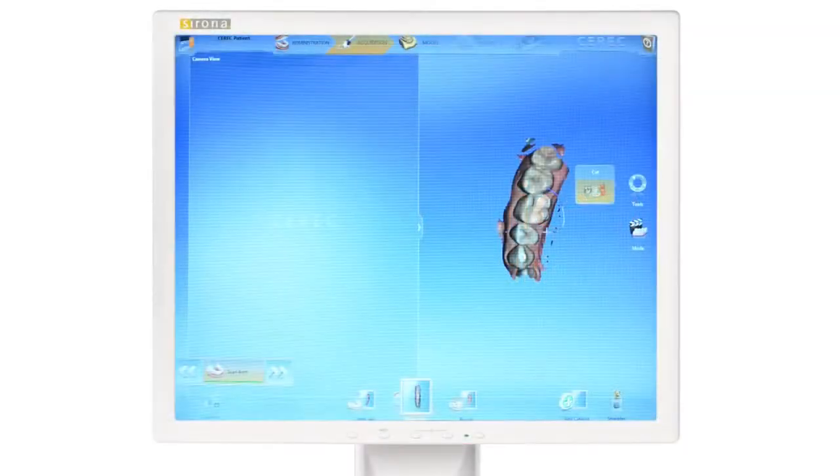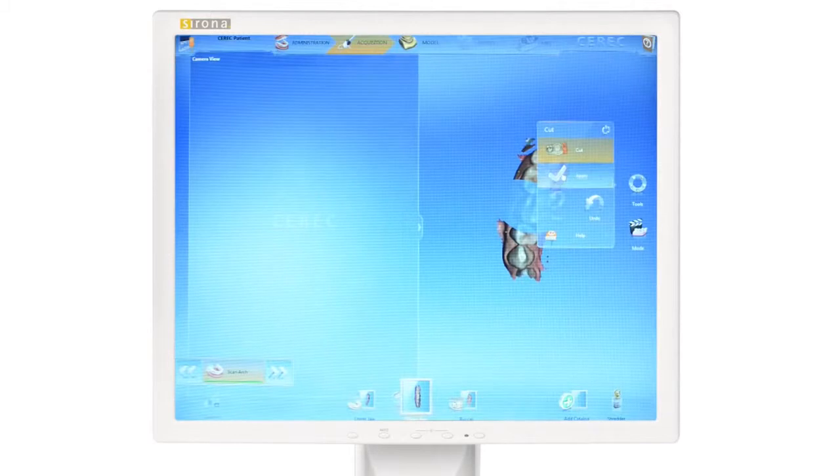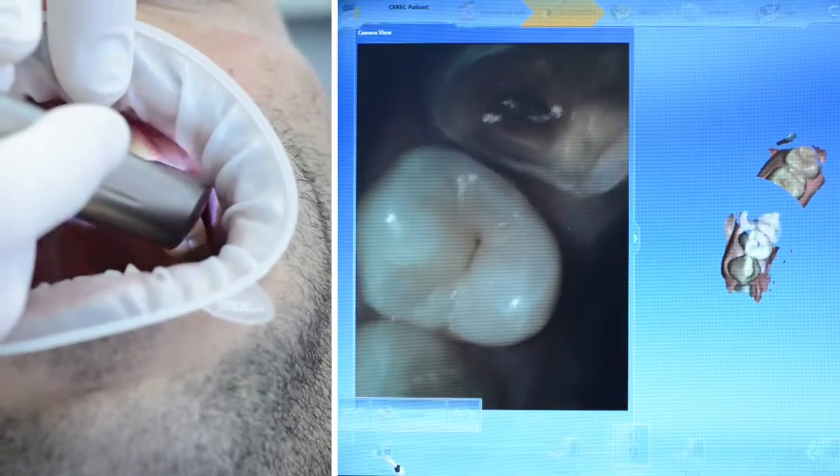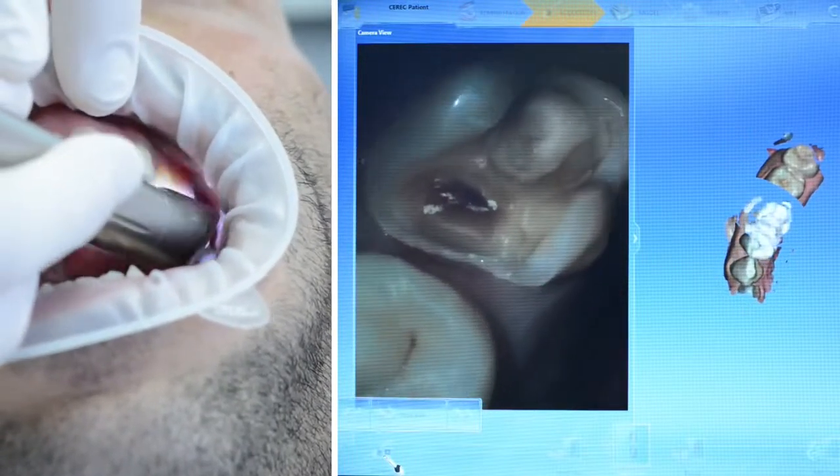With Omnicam, the model captured before the preparation can be altered by removing the original tooth with the cut tool. The prepped tooth is then scanned and automatically added to the existing model.